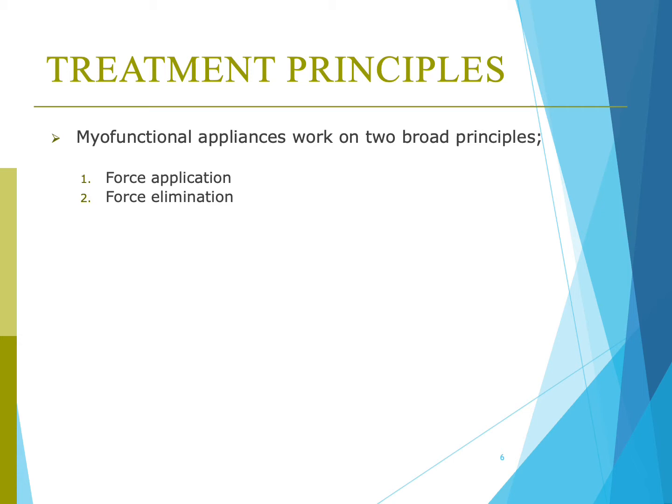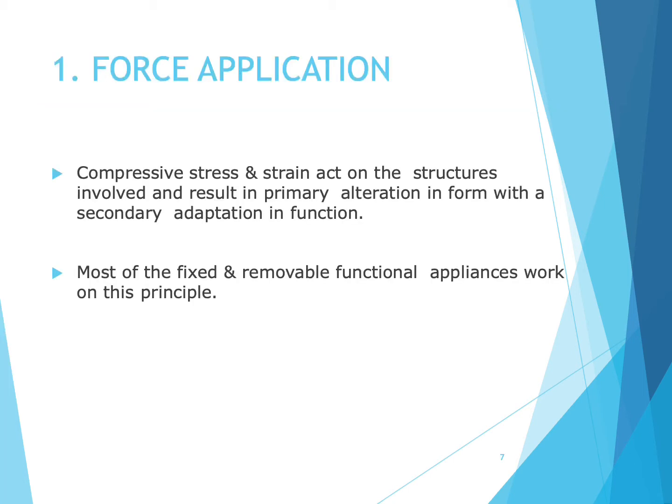There are two broad principles of the myofunctional appliance, which are force application and force elimination. Force application is when compressive stress and strain act on the structures involved and result in primary alteration in form with a secondary adaptation in function. Most of the fixed and removable functional appliances work on this principle.